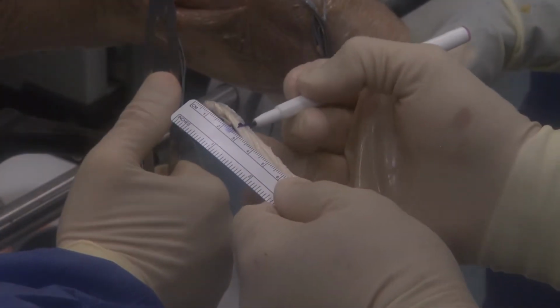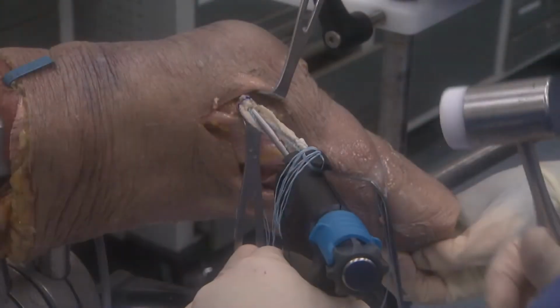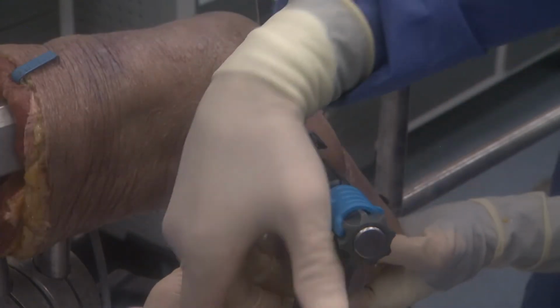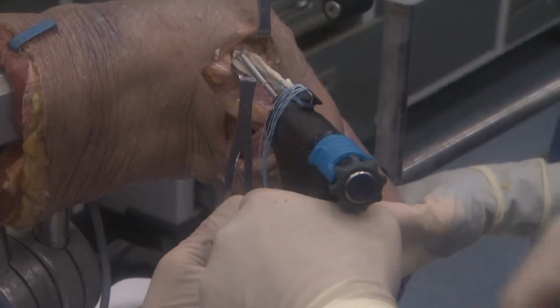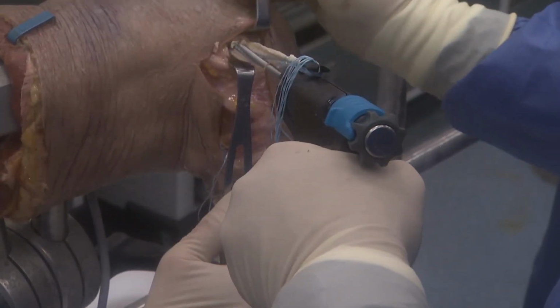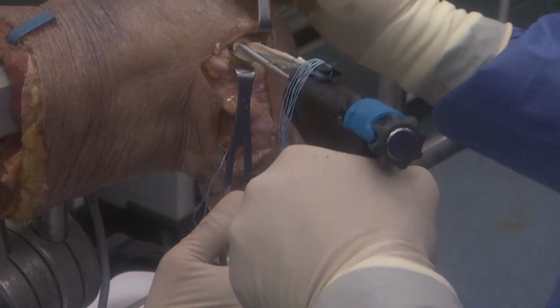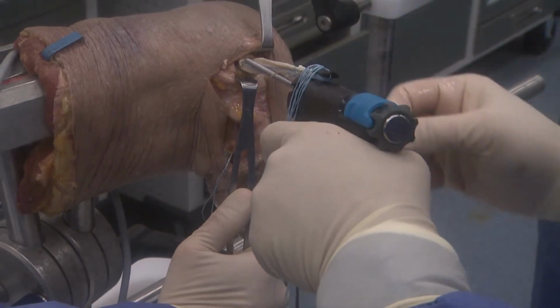So I want to mark this at 25 millimeters, and I've drilled a 30 millimeter tunnel, and I mallet it into place. Then I need to unhook the handle to allow me to insert the implant. I put a compressive force as I insert this, squeeze the trigger, and as soon as I hear that lock, I know that my device is deployed.